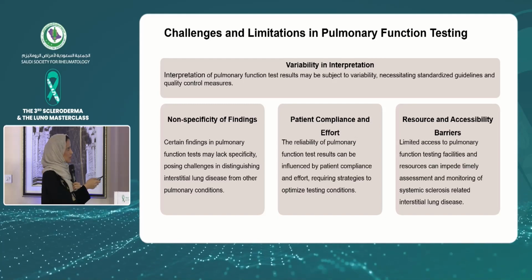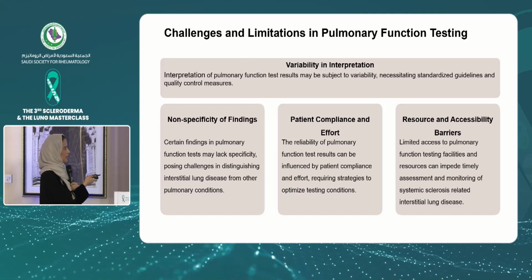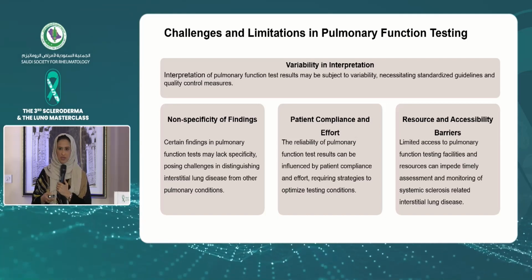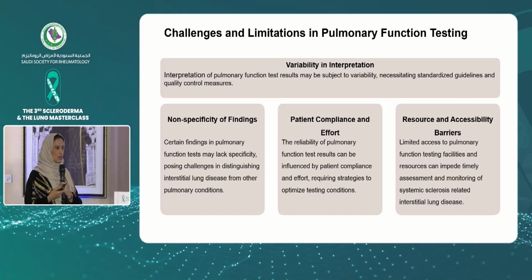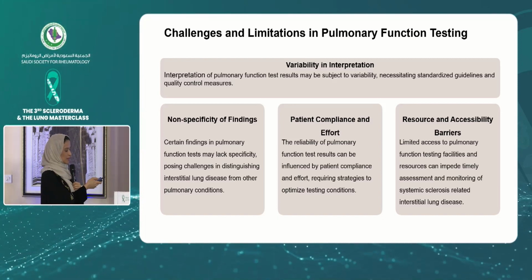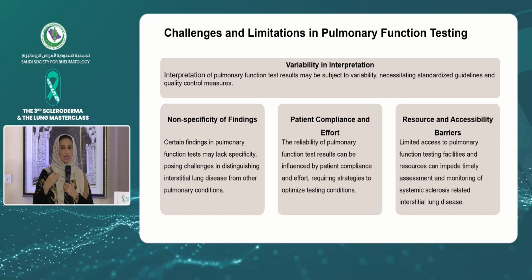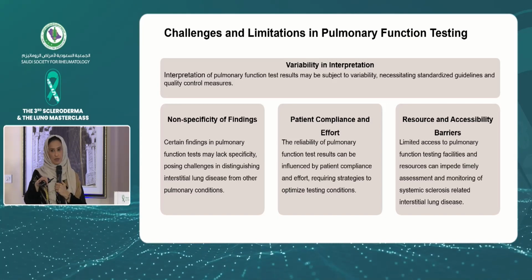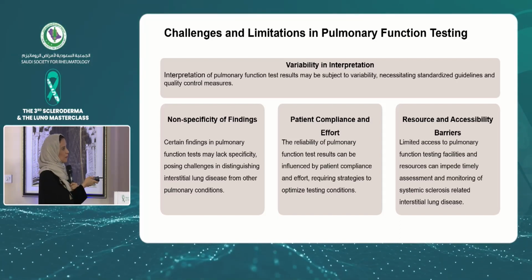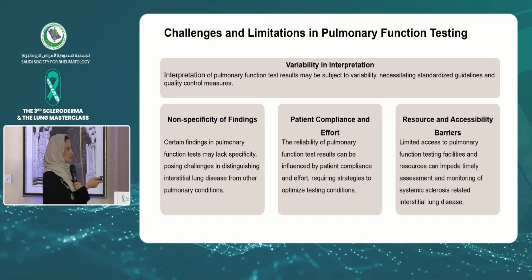So the challenges and limitations and variability, as I highlighted, be careful of that. No specific findings. If I find FEF 25% to 75% decline, it's not specific to our population, let alone to CTD populations. Patients' compliance and effort is very important. In my practice, when I note a decline in PFT, I repeat it at 3 to 4 weeks to document sustainability of the results, because the results are quite effort-dependent when you repeat the tests. Resource and accessibility is still a huge burden in some of the centers.